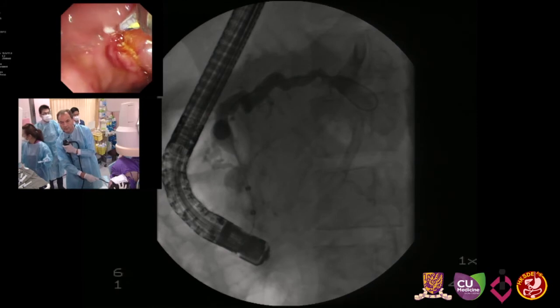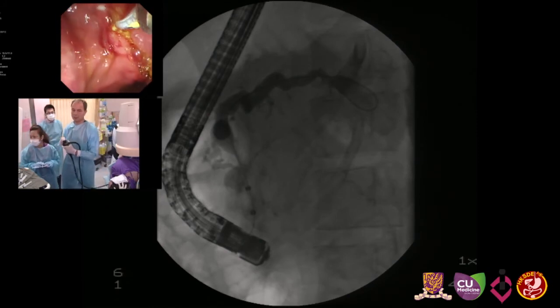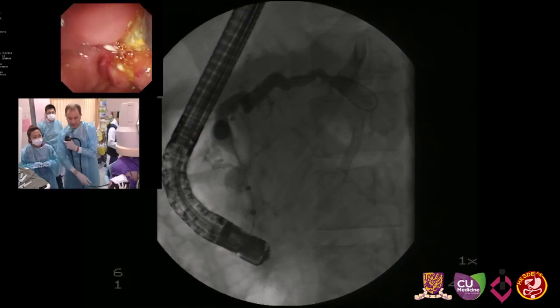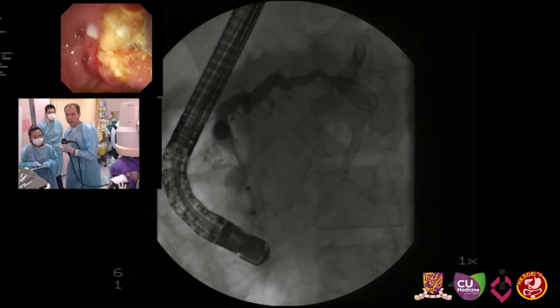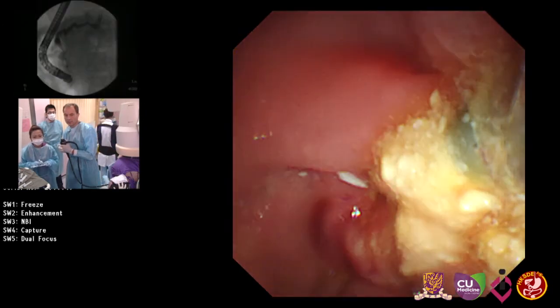So how long would you like to keep the stent inside? Three months. We see if we could negotiate the stricture or if we have to replace the stent and do it for one year. Okay, thank you very much. And as you can see now, how much material comes out of the duct. Good. After complete fragmentation.